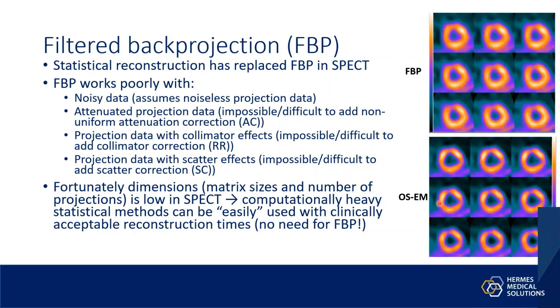FBP also works poorly with attenuated projection data because it assumes that the projection data is perfect, and it's, I don't like to say impossible anymore, but at least it's quite difficult to add non-uniform attenuation correction in the FBP algorithm. I know that there are some papers out there, but it hasn't really been utilized in the clinical environment.